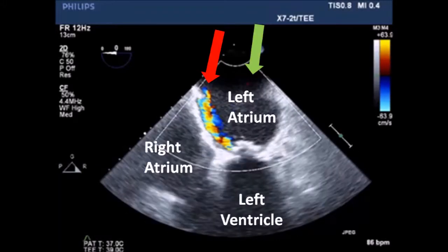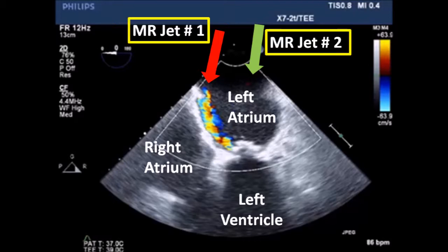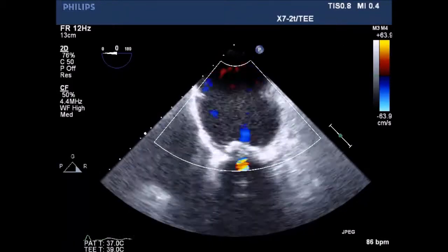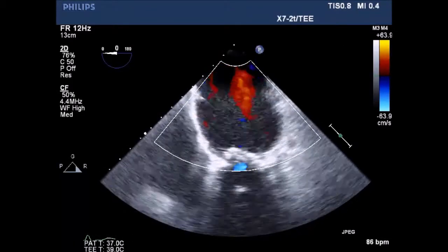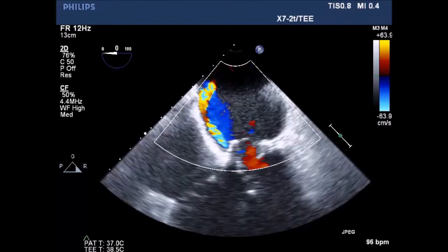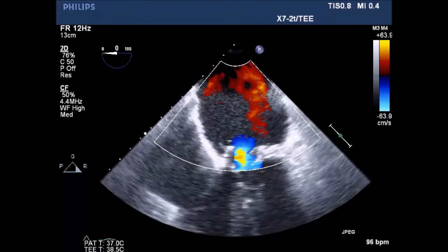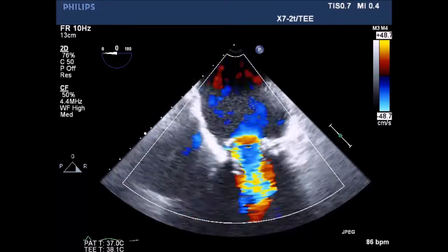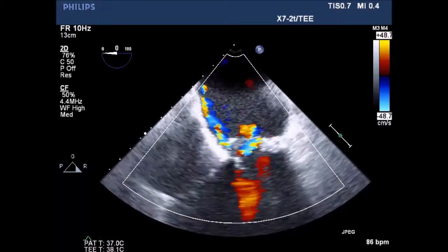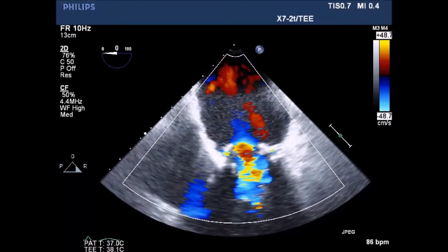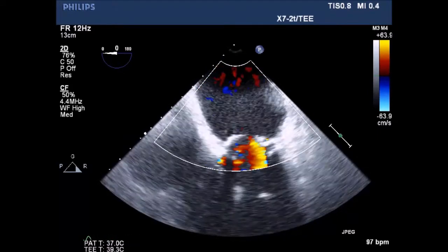Note on this four-chamber view two distinct MR jets — one in focus on the red arrow and one slightly off-axis on the green arrow. As we continue to rotate the ultrasound probe, it will become clearer that there are two distinct MR jets on this patient. Both were paravalvular leaks.